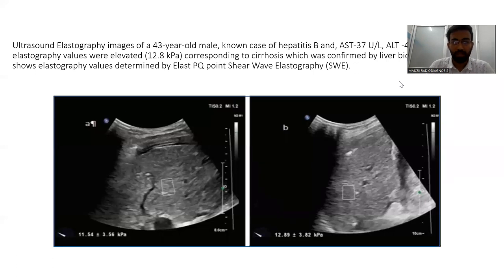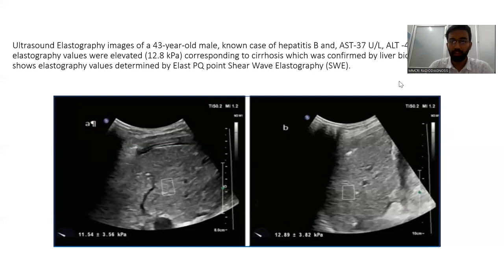These are ultrasound images from which the elastography score was acquired. The elastography score is shown in the bottom left of both images. These were obtained using ElastPQ point shear-wave elastography for a patient with chronic hepatitis B, with AST value of 37 and ALT value of 41. The elastography score was 12.8 kilopascals, corresponding to cirrhosis, which was confirmed by liver biopsy.